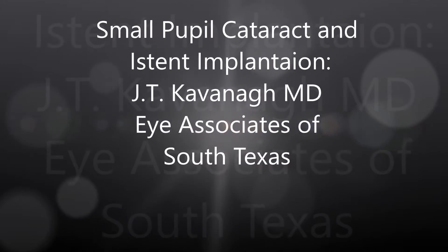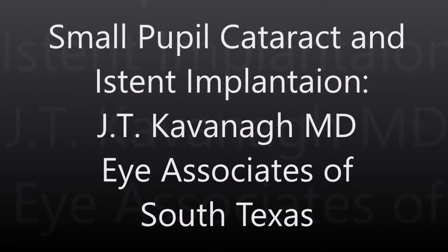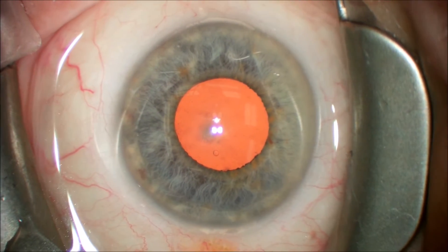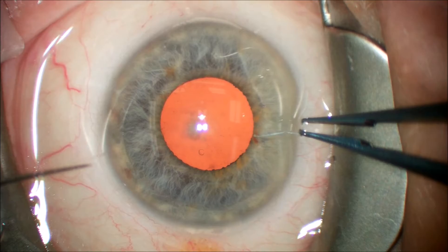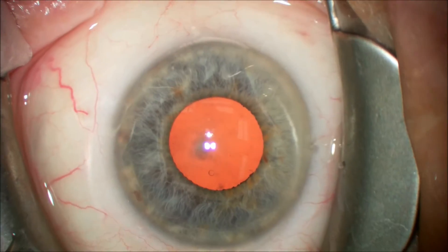This is Dr. Kavanagh, Eye Associates of South Texas. I'm going to show you a small pupil cataract surgery and iStent implantation on the same patient. This is a patient with a moderately dense cataract who had coexisting mild glaucoma that we were going to implant an iStent in at the end of the cataract case.